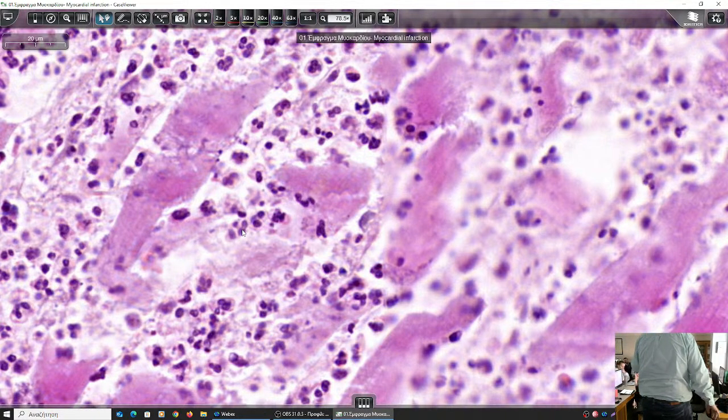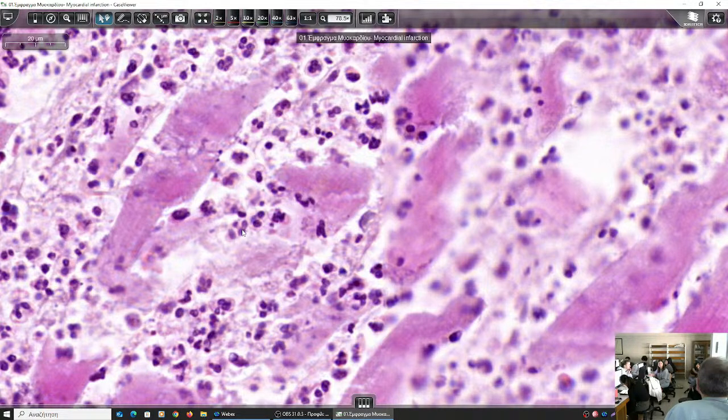So what were we saying? Which cells have the lobulated nuclei? The neutrophils. So these cells come there about after 12 hours from the onset of the infarction. So we just see the neutrophils. These are the first cells which are motivated by the acute inflammatory process. And here, which is the stimulus for inflammation? Necrosis. Because inflammation is activated with any sort of damage. It could be a microbe. It could be an excess heat exposure of the tissues. Here is the necrosis. So necrosis causes inflammation, and after 12 hours, we see the lobulated nuclei of neutrophils.